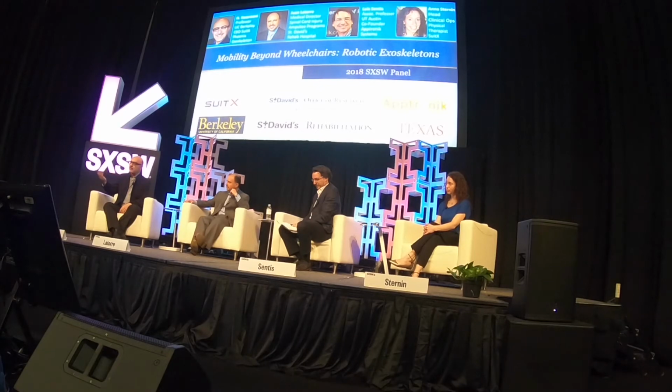So most of you drive cars, the more you add into it, the more features you put into it, of course, people enjoy it, but the price will go higher and higher. Now, of course, that's not a challenge for the engineers or designers. The challenge is to give a good performance with lowest price. To me, that's a very difficult thing to do. So what we did here, we removed as many sensors as we could, because sensors may not be expensive by themselves, but eventually once you put them in the device, it reduces robustness, it might fail. You need wires and connectors and computers, everything you need. So we try to remove sensors and use intelligent systems that actually estimate rather than measure things.